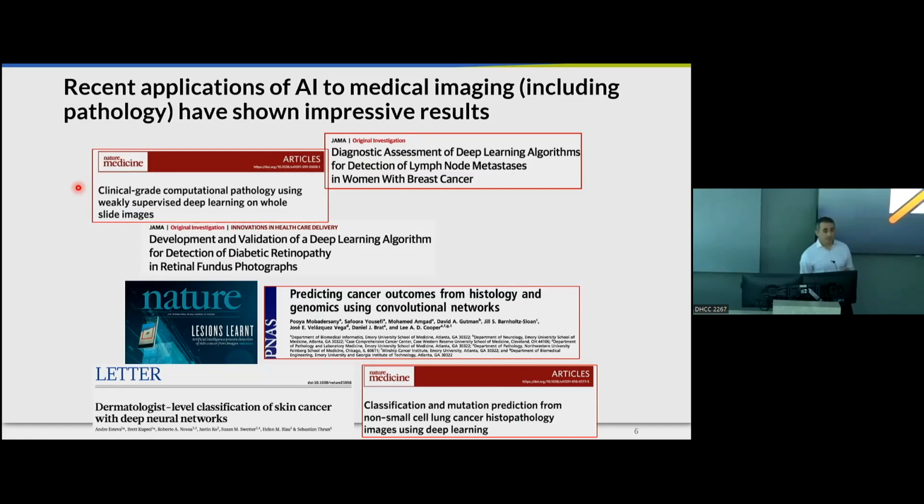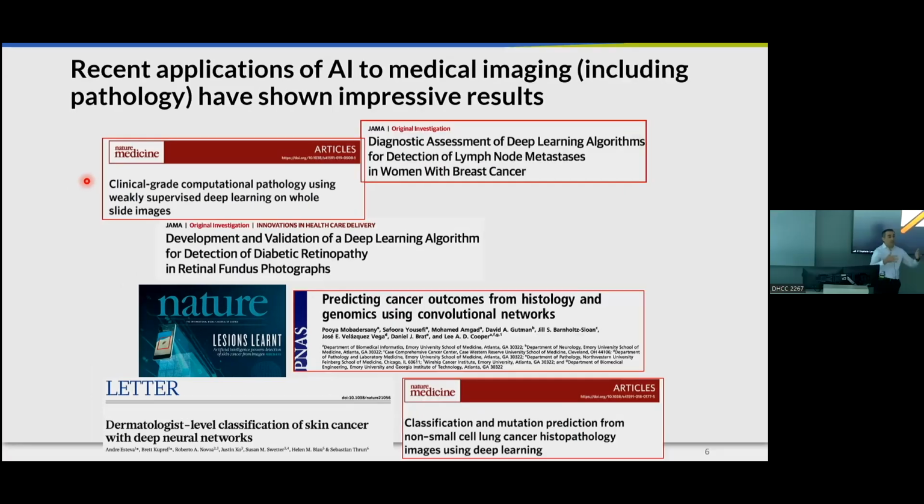And it does actually much better than pathologists. Not that they're better, it's just that in a time-limited environment, if you have, let's say, a minute to review a slide, which one would be actually better? Obviously, AI is a machine that, if you have a lot of computation behind the scenes, can be human-level.